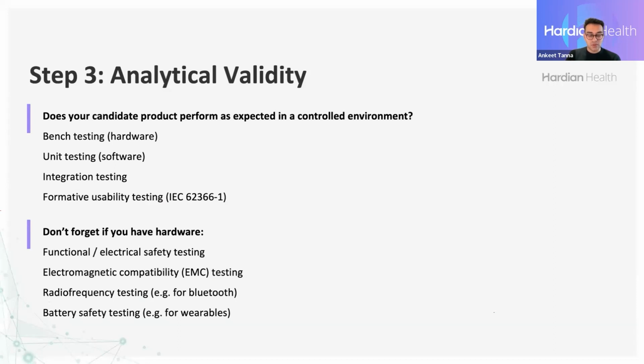When it comes to formative usability, if your device has a user interface which is used by a patient or a clinician or a healthcare professional, this is the time to also think about ironing out any issues with the user interface and usability in a formative way. So it's a very small sample of a representative set of users to see if there are any issues in terms of how the data is presented or what the journey is of the patient through this software device.